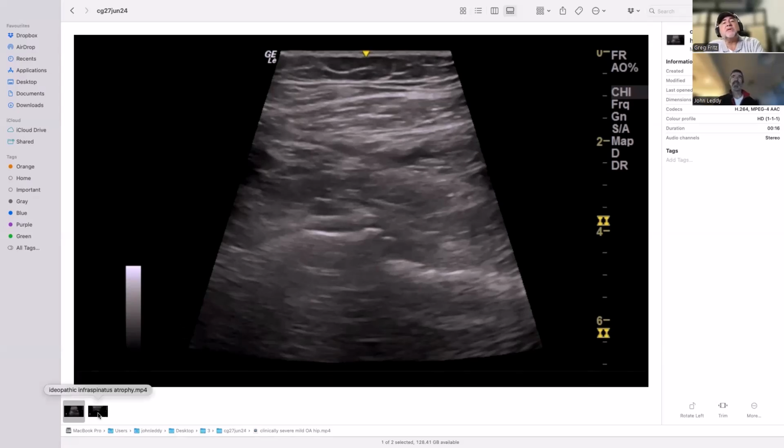And I think you were also telling me that you have added the inferior imaging of the humeral head, and you can see sometimes the bulges of the osteophytes there, but not as sharp. No, sometimes it's sharp. We definitely see that quite a lot.